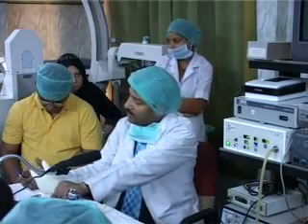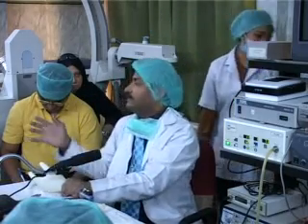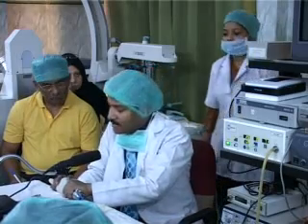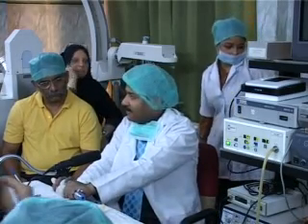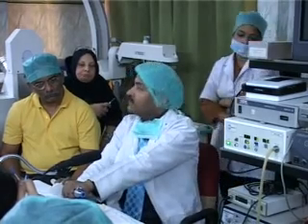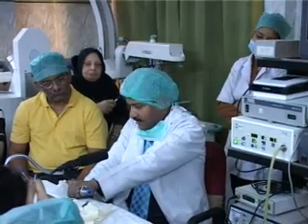In all companies, it depends upon the amount of leak. If there is no leak, the flow rate will be 0, and if there is any external pressure like that, it will wait for 5 seconds, and after 5 seconds this alarm starts, and then it will take it back. Now it is taking back.